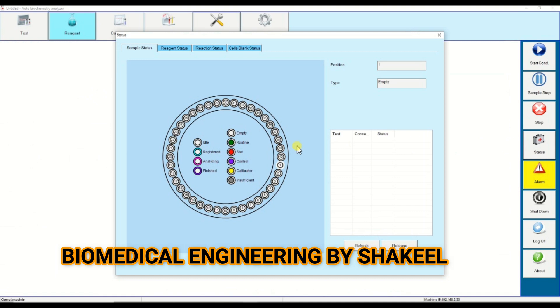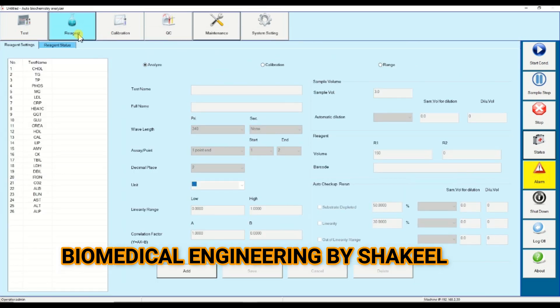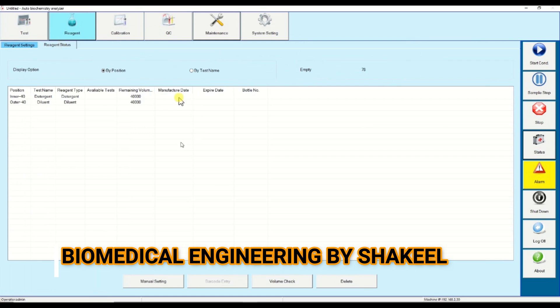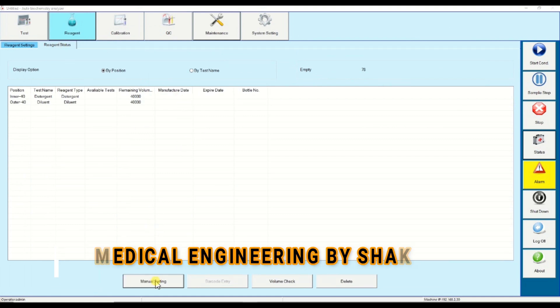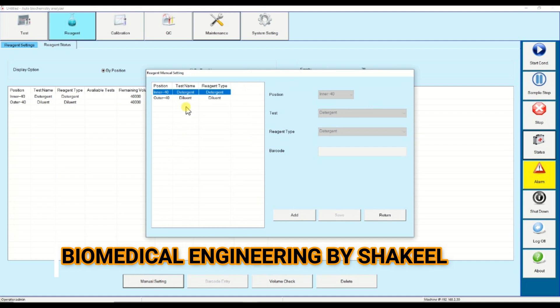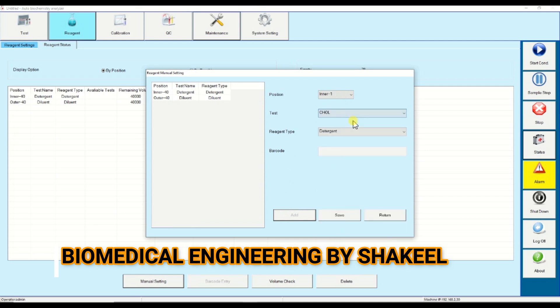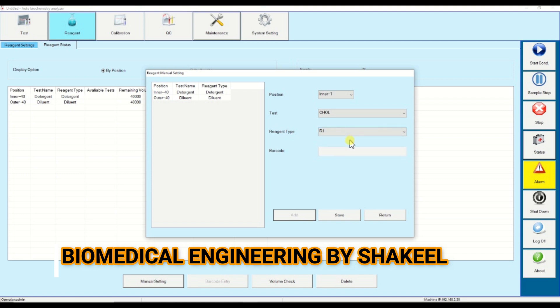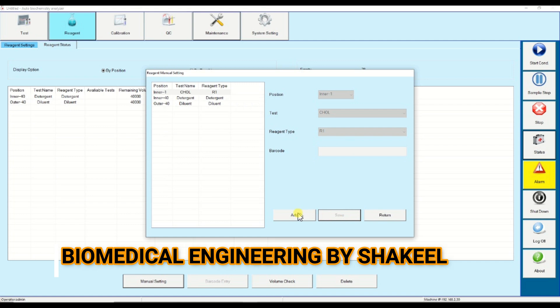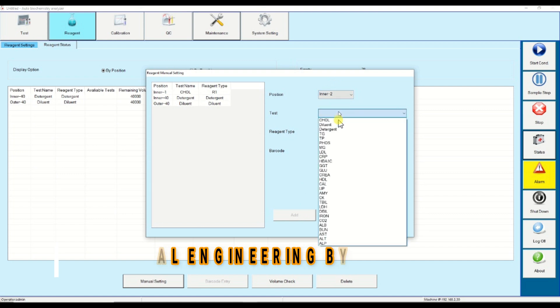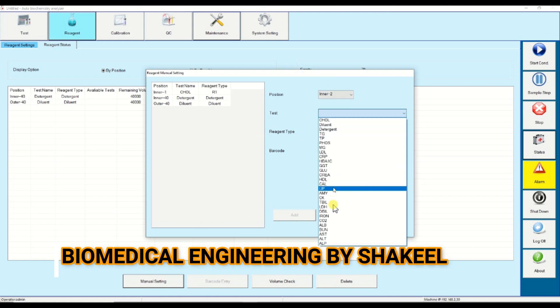Now I will tell you how to assign the position of reagent. If you are using a barcode reagent, the machine will scan and assign automatically. If you are using manual reagent, click on reagent, click on reagent status, then assign the position — click on manual entry. There are two positions: inner and outer. Click add, select the position — suppose position number one inner — click on cholesterol R1 and save. Now you can see cholesterol is assigned at position number one inner. Same way, click add and assign positions for other tests.